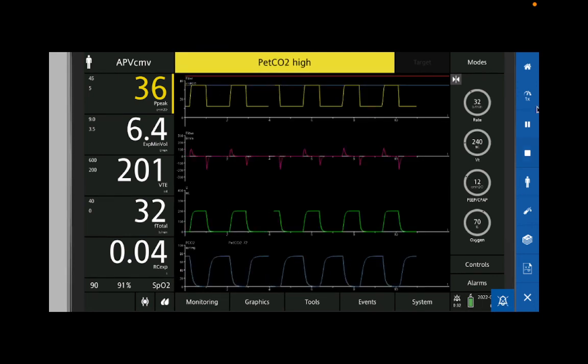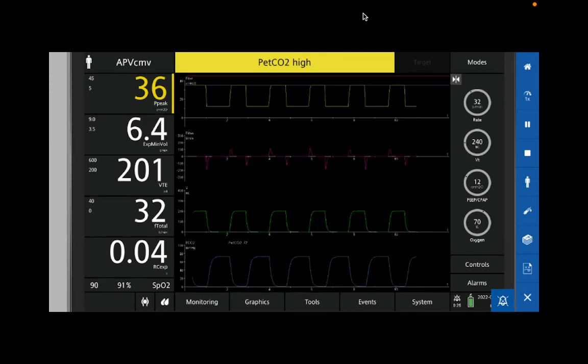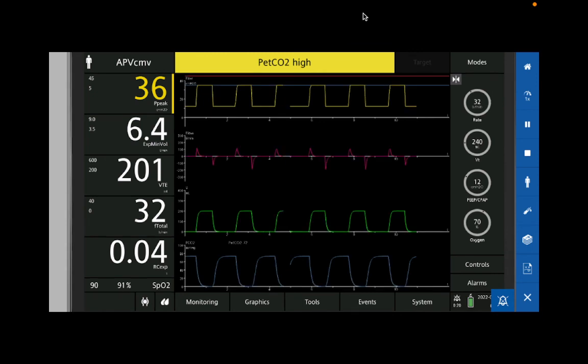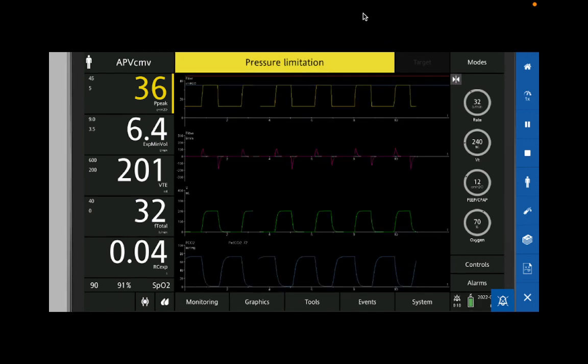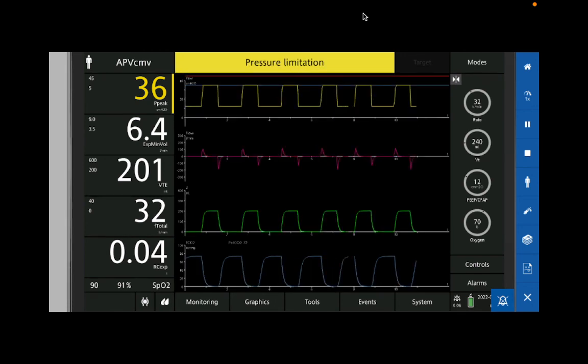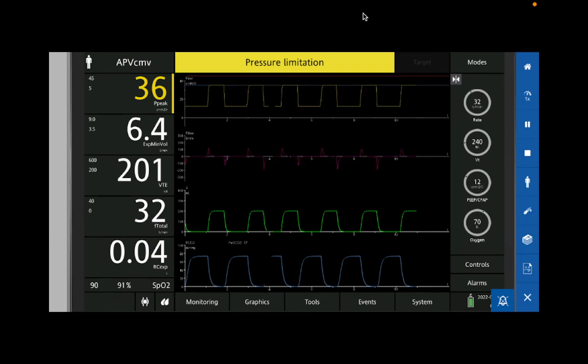Slowly. You might see an acute jump, but it's going to take time. So I've done it before where they're on an FiO2 of 100, their sats are 80. I increase their PEEP from 6 to 12, and I watch it come from 80 to 83, and I sit there some more, and we get an x-ray, and I sit there some more, and then I see 85, and I say, good. I tell the nurses, call me if it goes below 85, and I go and do other things. And then I come back 2 hours later, and they're satting 95 because they've popped them open. We moved to that lung.